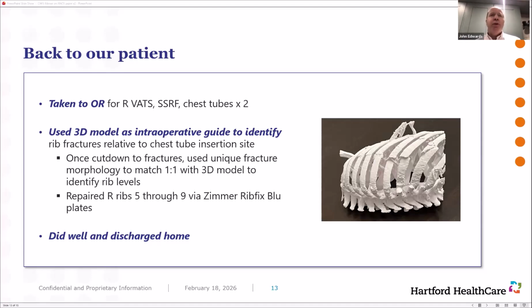I found it very useful for some of those, also for some chronic non-united sternotomies, where again I've just been trying to work out in advance what plate system to use. And I just have from the suppliers a bunch of non-sterile plates of certain types that I can use to play around with the 3D prints.